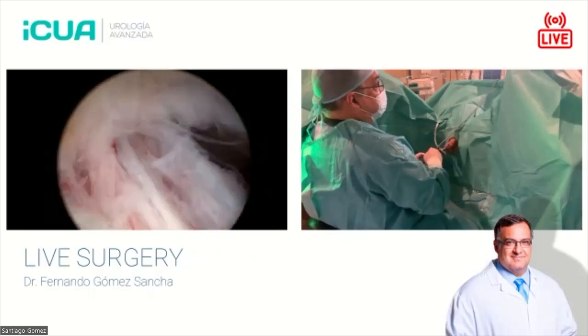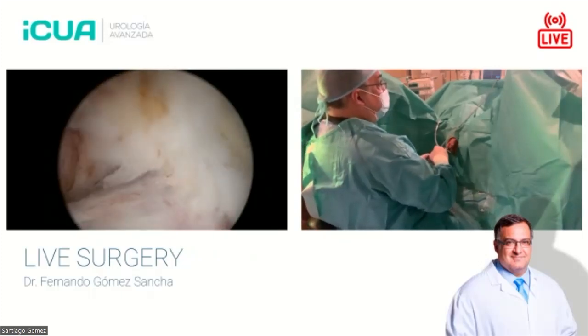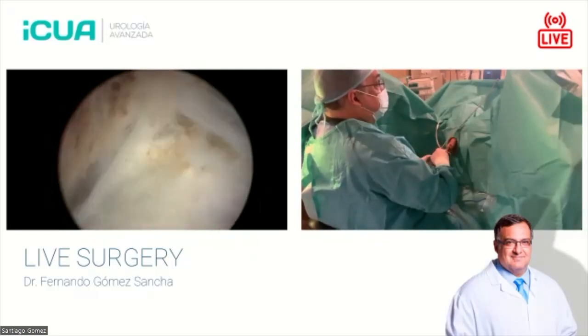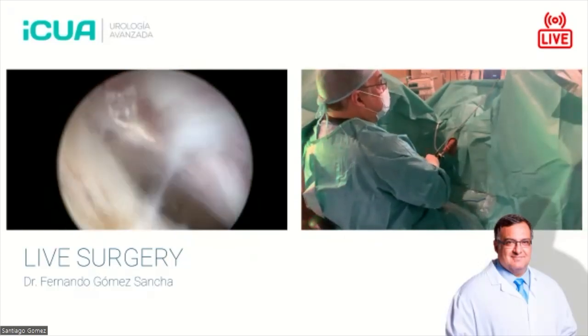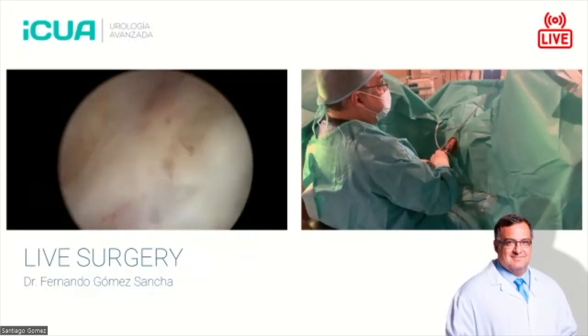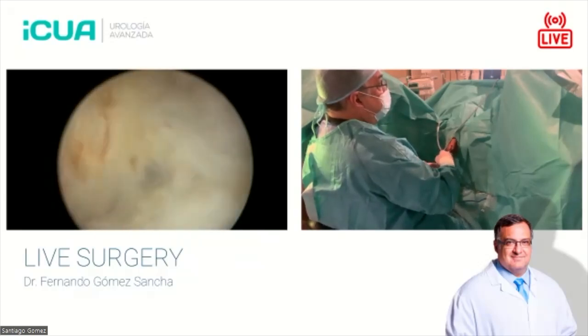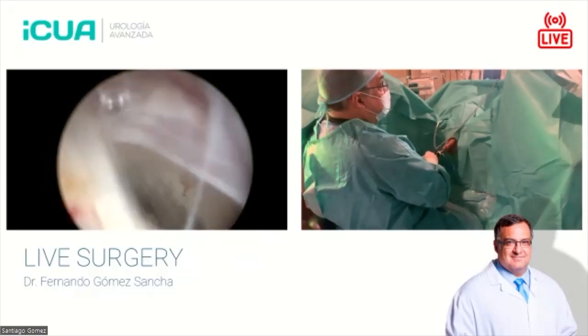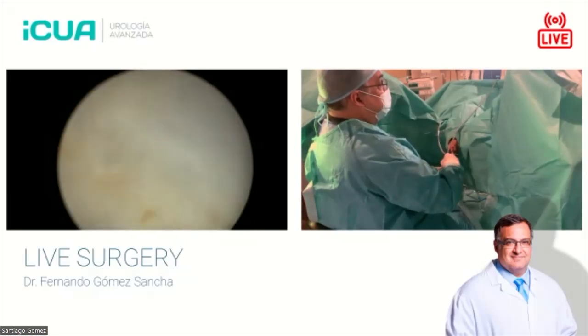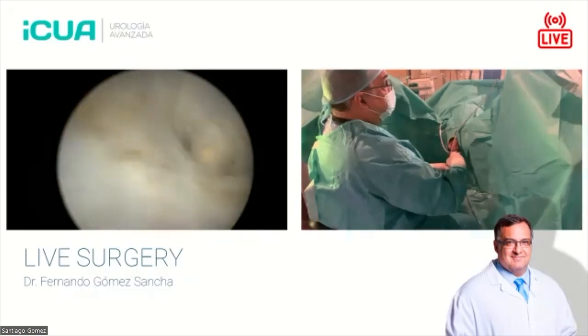Here again, you see, I have some attachment. So I come out towards the apex, and then I try to cut the apical attachments first. You see, trying to progressively approach the 12 o'clock region. Here, you see. So very carefully, trying to avoid traction on the sphincter area.